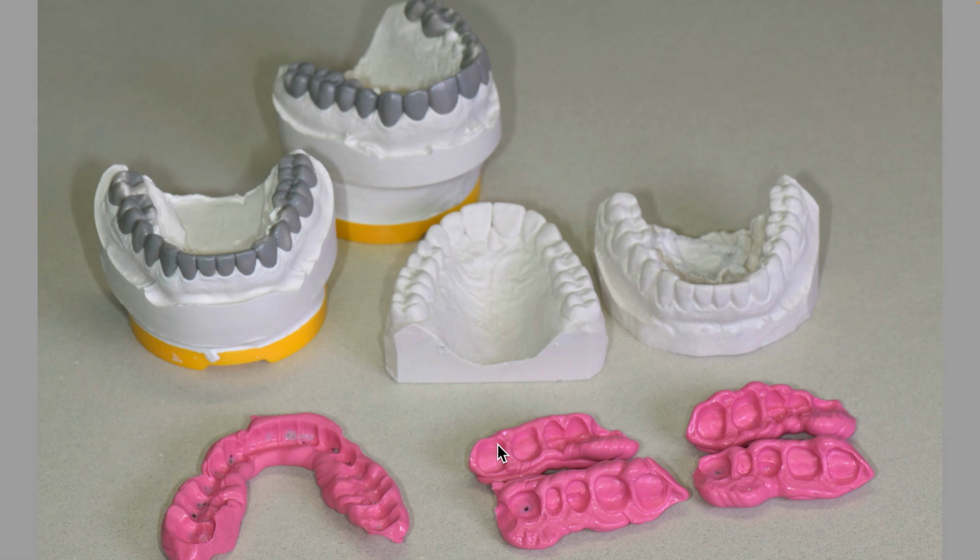So here is everything being sent to Harold, my ceramist. I do take 2 sets of these bites, upper preps to lower provisional, and he checks them with a device called the MPI. You might have seen that on some of our webinars. The MPI allows us to verify the bites are identical. If they're not, then I would have the patient back and take more.